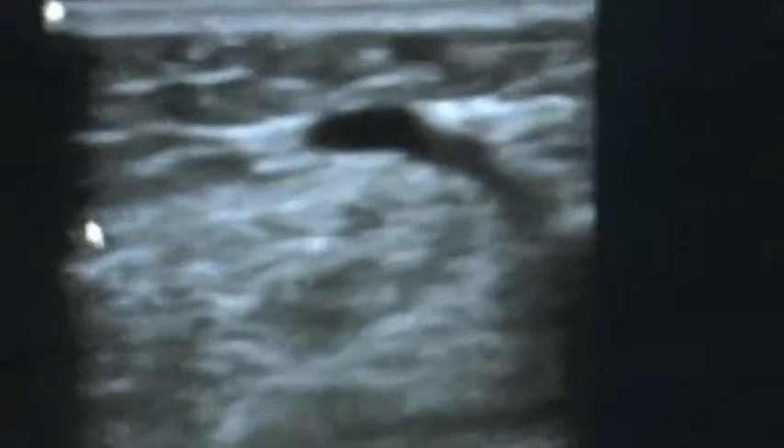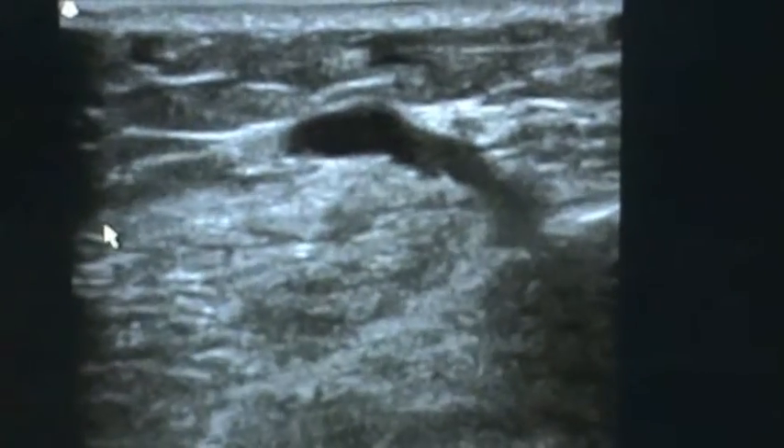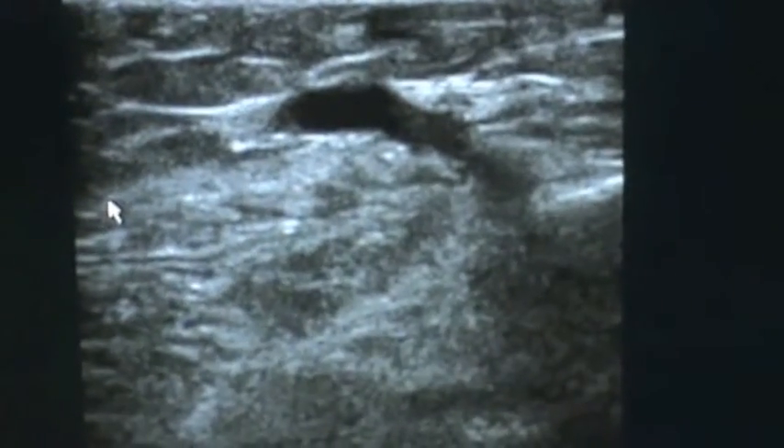Here's the ultrasound before we start, and you can see the perforator we're going to treat. We're going to inject both foam and do a laser. I'll show you that here in just a moment.